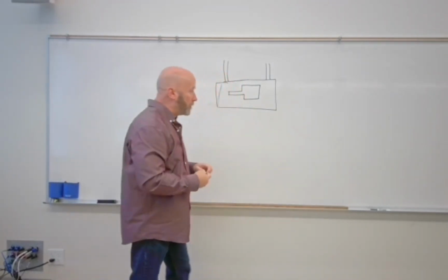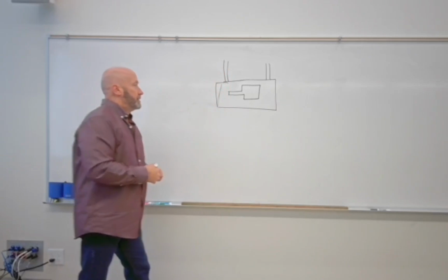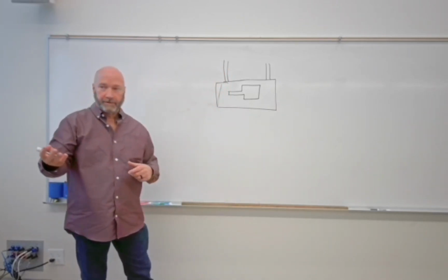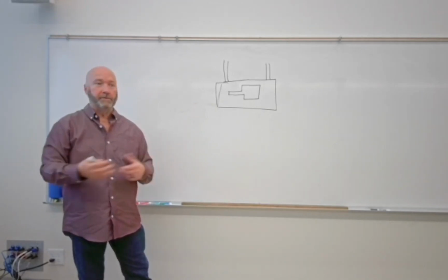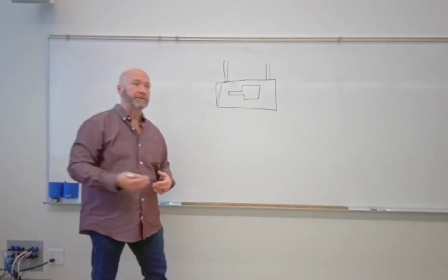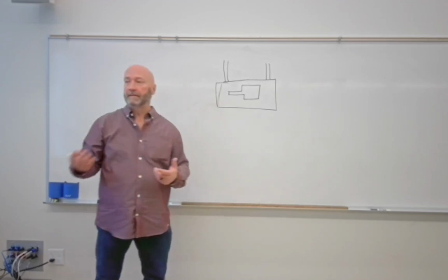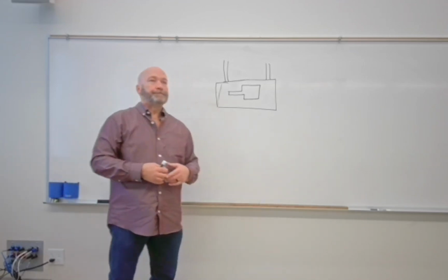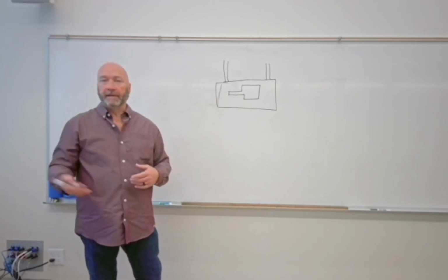Okay? So protective housing contains oil, right? The main thing that kills the X-ray tube, limits X-ray tube life, is heat. We've been through that, and we're going to touch on some of the other ways that that's going to happen today. But one is just buildup of heat, right?